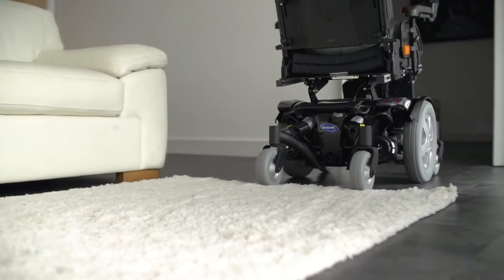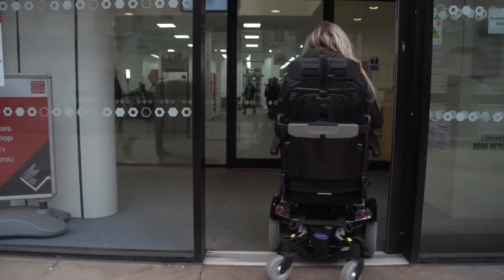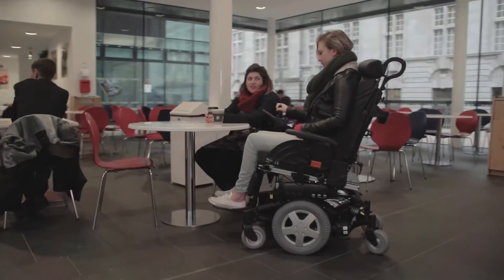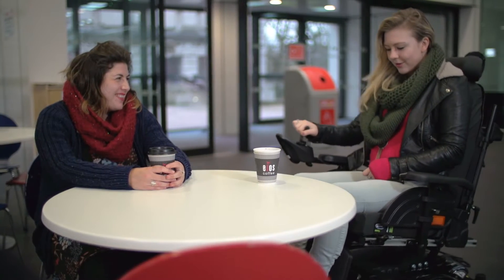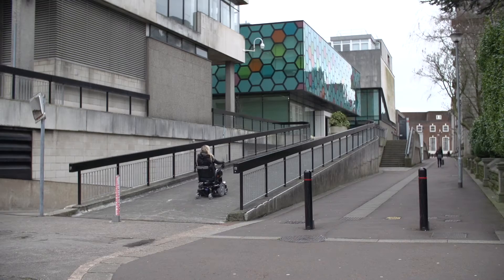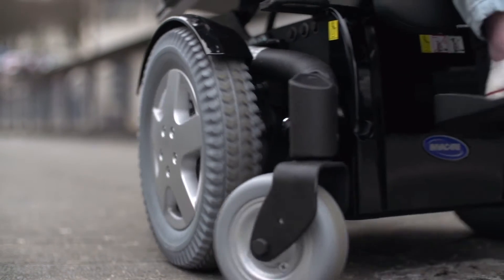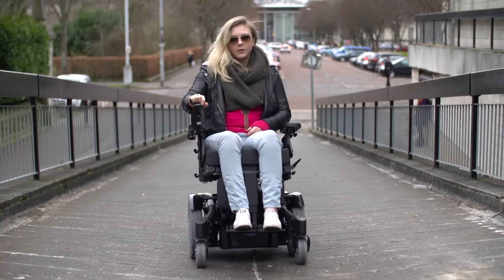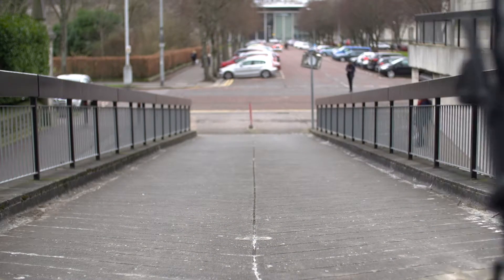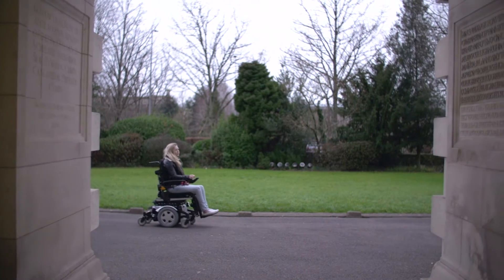Another concern is accurate low speed control, for example while going through doorways or approaching a table, as a number of corrective actions are needed to get the power chair to the correct position. Lastly, there is the poor slope hold, which when the chair stops can cause it to slightly roll back when the user starts driving again. This can leave the user feeling nervous and lacking confidence in the power chair.